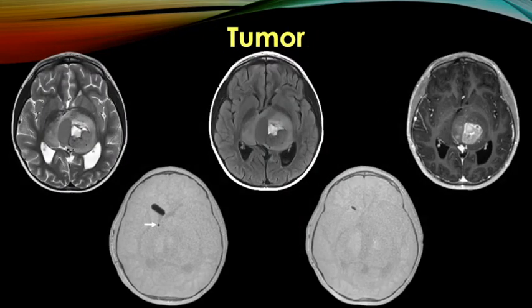This unfortunate patient had a high-grade bithalamic glioma. You can see here the infiltrative nature with some internal hemorrhage and necrosis, as well as enhancing soft tissue, causing obstructive hydrocephalus. So after shunting, we performed a rapid MRI, including ZTE, only a few minutes protocol. And now you can see the post-shunt intraventricular pneumocephalus, but also the shunt tip.